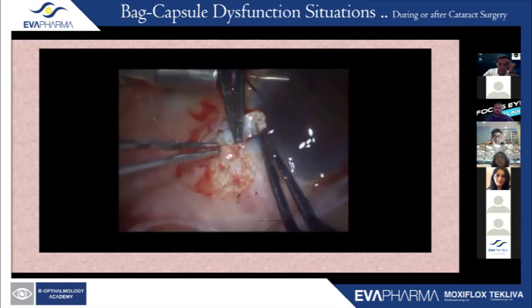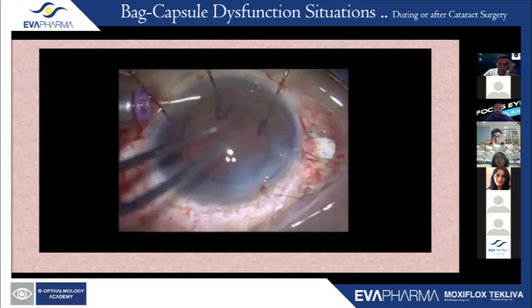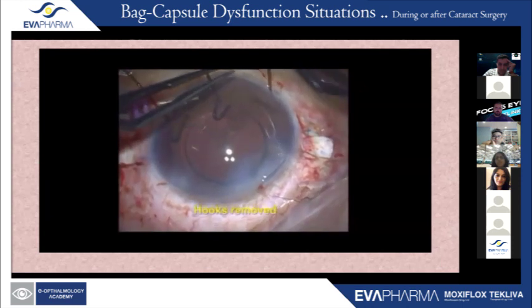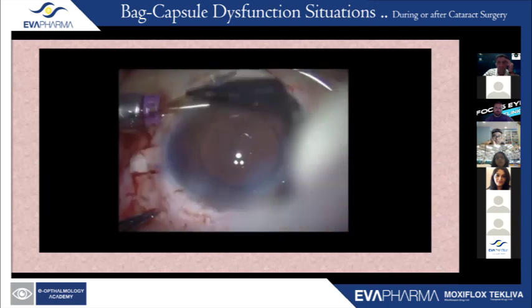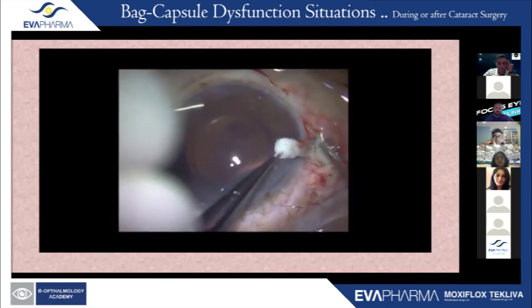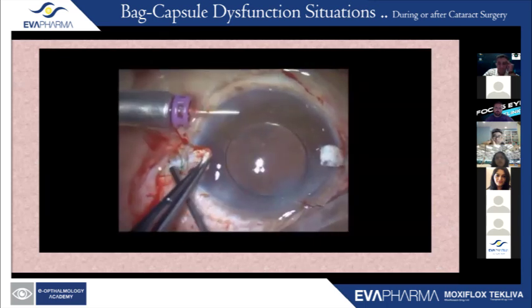So remember, this is a case also of progressive zonulopathy, and that really makes it advantageous because you've got long-term fixation as well. You've reduced your chances of posterior segment complications. You've basically not entered the vitreous cavity at all.